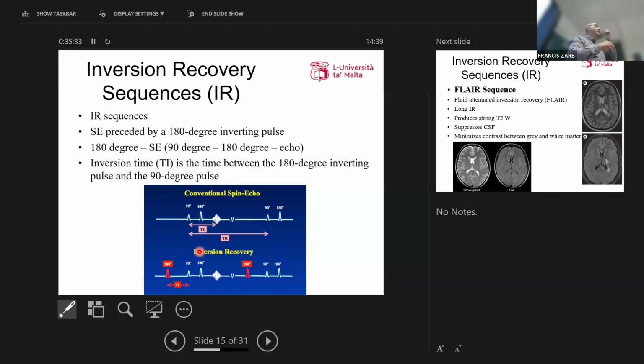Or multiple sclerosis: you have demyelination, and in those spots of demyelination, I will have localized edema. Edema is still water, so both of them are water. Okay? If I'm on a standard spin echo sequence, I send the 90 degrees, take the echo, and it gives me the same echo. I cannot differentiate between normal water and abnormal water because both of them would have the same signal.